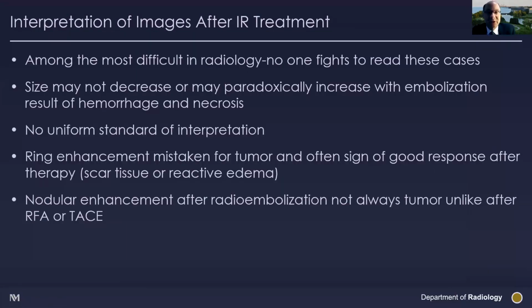As I like to say, interpretation of images after interventional therapy is among the most difficult in radiology. Certainly no one fights to read these cases. These are the cases that often stay on the PACS work list until a fellow or resident probably mistakenly opens it up or feels guilty. But I think after a lot of experience, I actually enjoy reading these cases, and I feel a lot more comfortable, obviously, than I used to be.